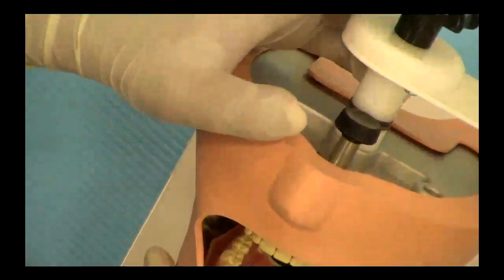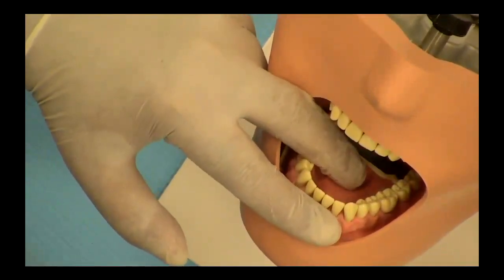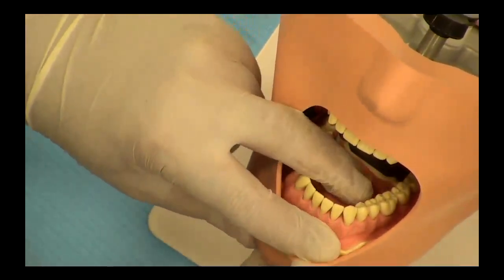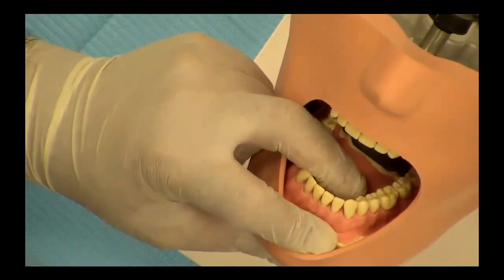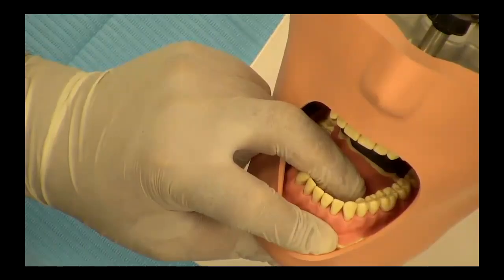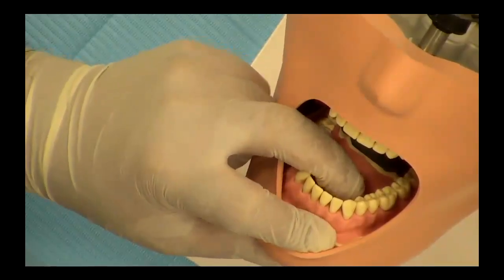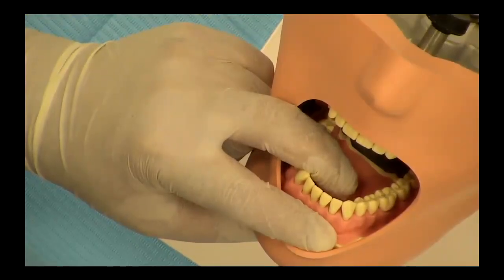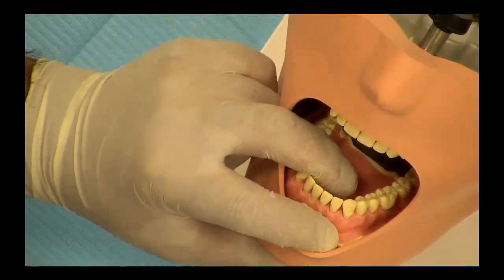Now for the mandibular teeth, you will have your middle finger on the lingual side, forefinger on the buccal side, and your thumb supporting the mandible directly underneath the tooth extraction, wherever you are carrying out the tooth extraction. This is very important because the mandible is a mobile bone. It's not fixed to the cranial base like the maxilla. So you must support the base of the mandible with your thumb.